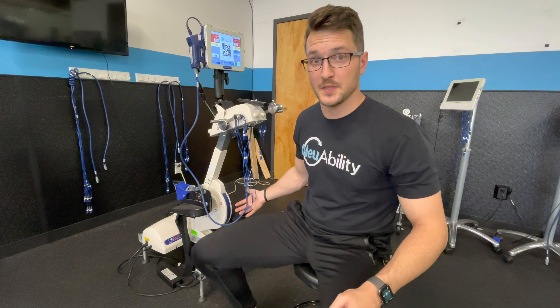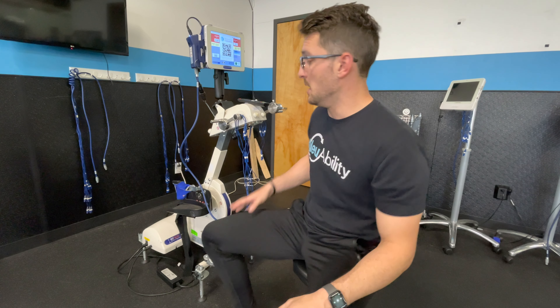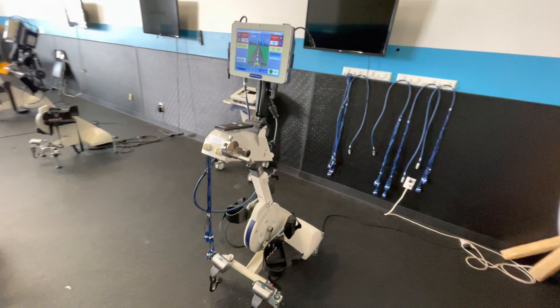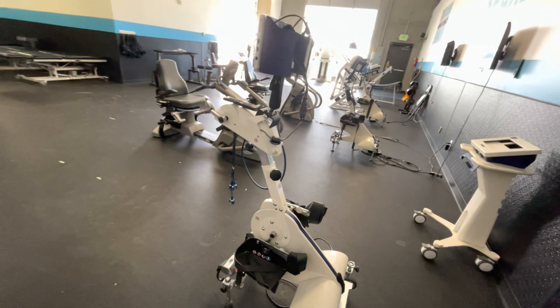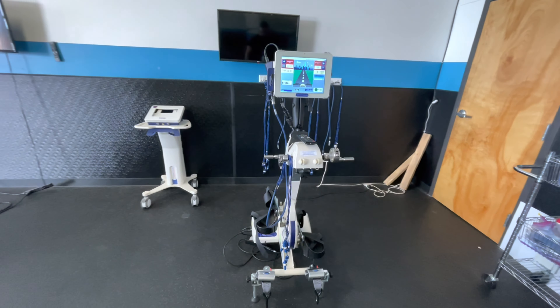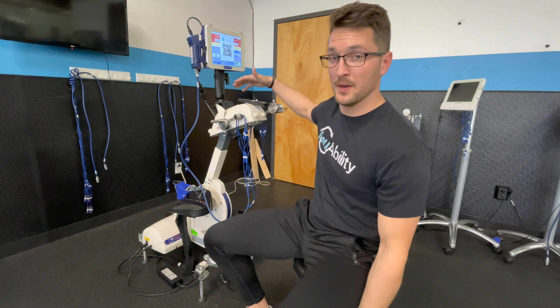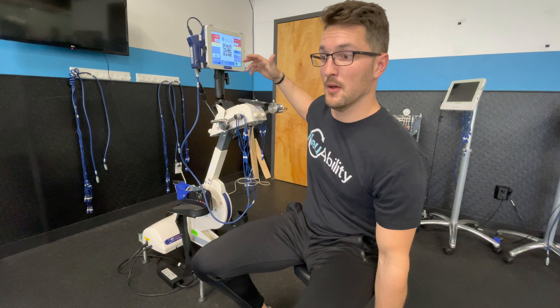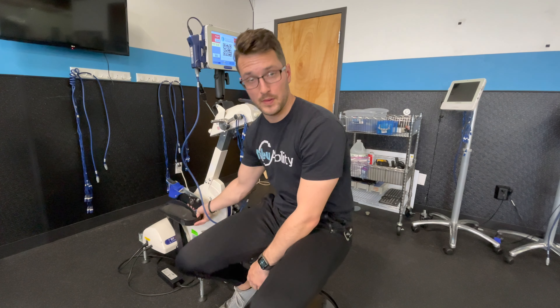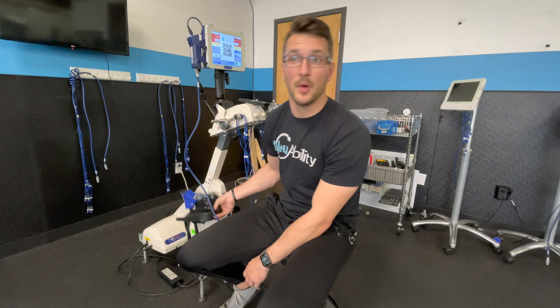What makes this machine very special, customized, and obviously very expensive is the utility behind it. With this machine we're placing electrode pads on quadriceps, hamstrings, and glutes as the primary target method. We then align the corresponding muscle groups to get stimulated at a level that presses into the resistance the bicycle is providing for the client, simultaneously allowing the client to ride a bicycle.